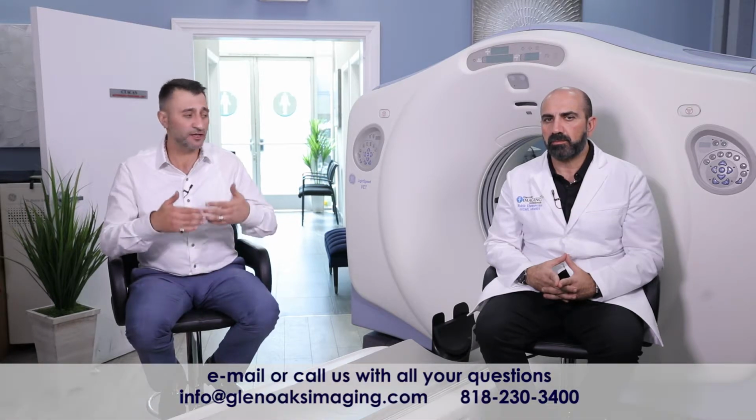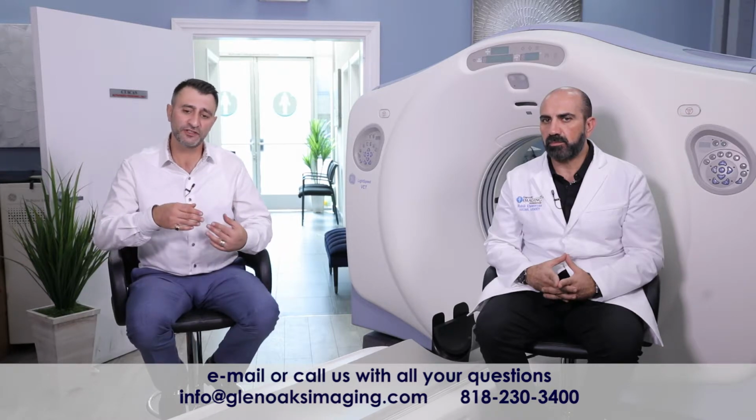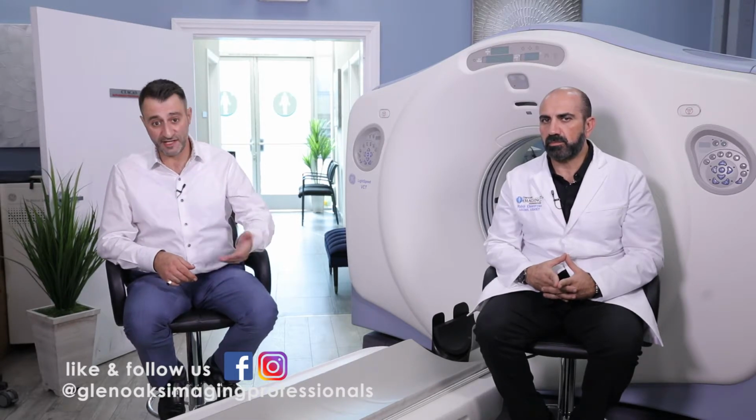On the other side, CT is based on the concept of X-rays. It has an X-ray tube. The only difference is it doesn't have one detector. It has many detectors. That's why you hear about a 4-slice CT, 12-slice CT, a 64-slice CT, which is what we have. That just means it's a lot faster and a lot more powerful.